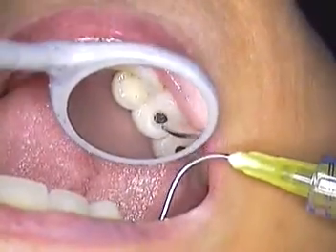All right, welcome back. This is Dr. Jerry Cuomo here in Boca Raton. We're in the final phases with June's case. I'm going to go ahead and just dry out the implant.